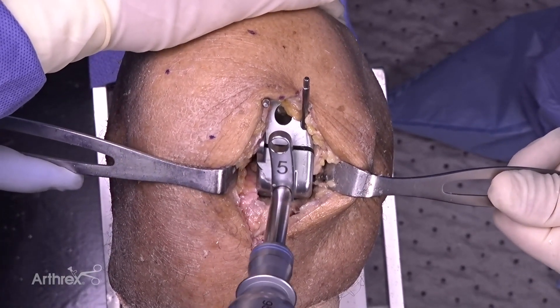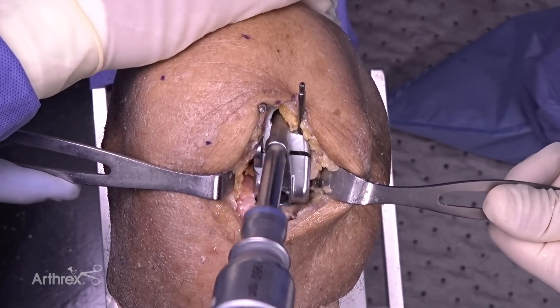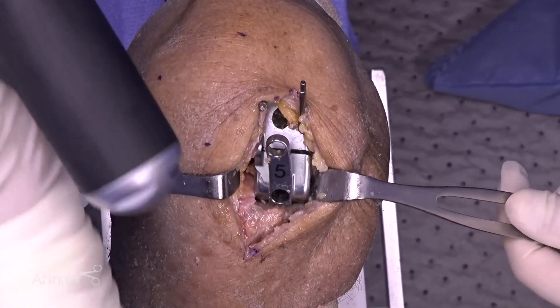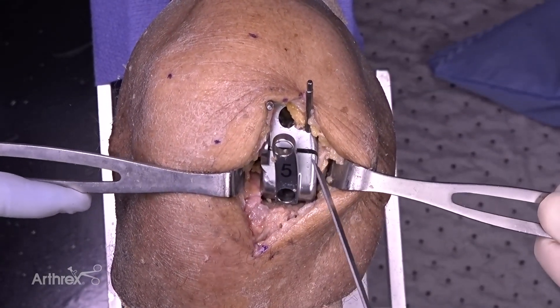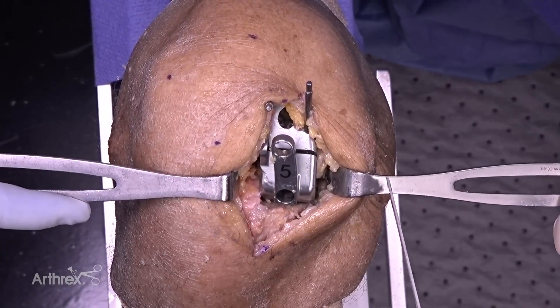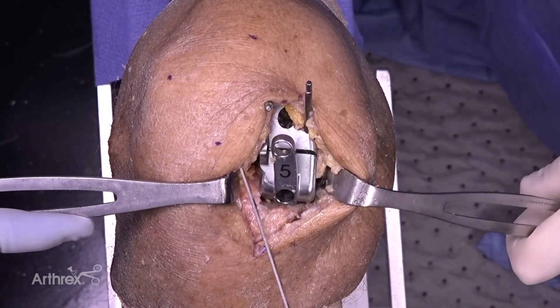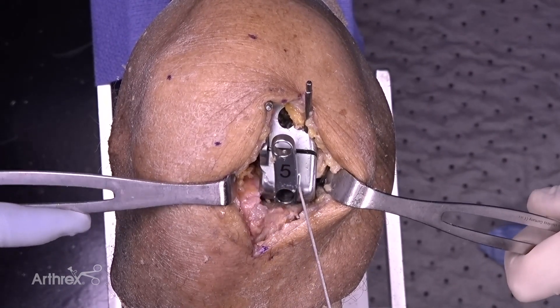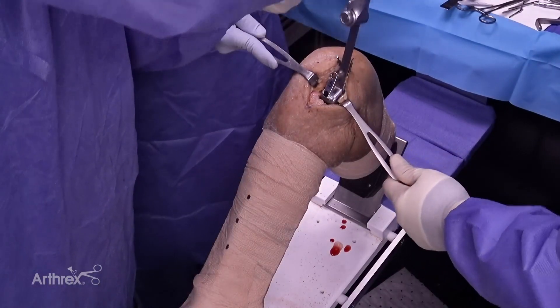The guide has a positive stop — drill those two lug holes, then go to your chamfer cut. The chamfer cut is captured; the only open area is on the medial side, where a retractor will help protect. It is captured and blocked on the lateral side, and the other side of the guide keeps the blade from going into the tibia — so it's very safe and well protected. We can then move our pins and femoral preparation is now complete.